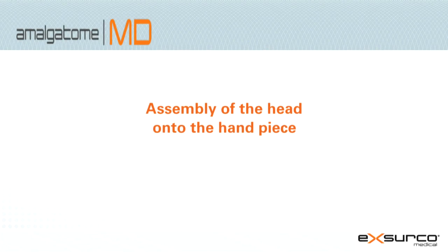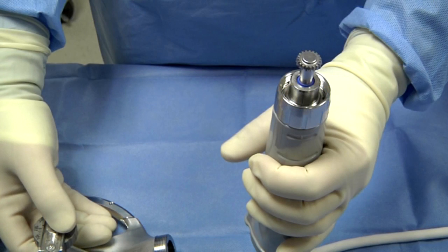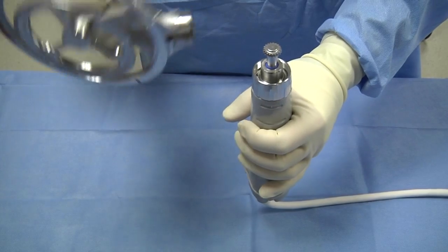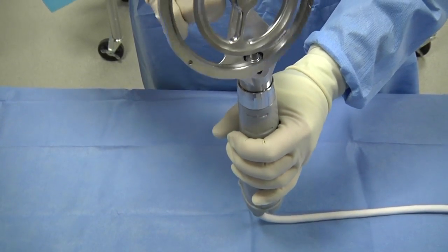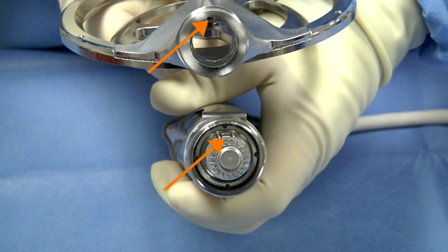Assembly of the head onto the handpiece. Ensure the device is not plugged into the power supply. Hold the handpiece in an upright position with the pinion facing upward and the activation lever facing the operator. Insert the pinion end of the handpiece into the housing on the head of the device, making sure to align the key and slot.